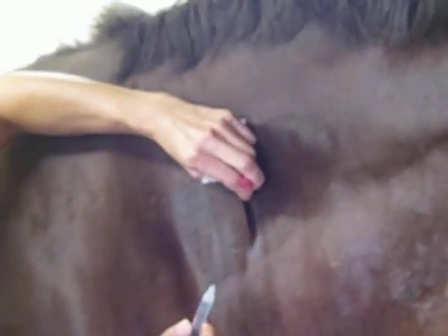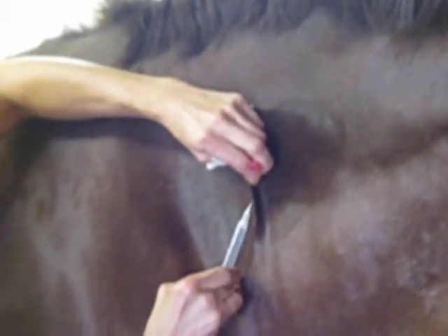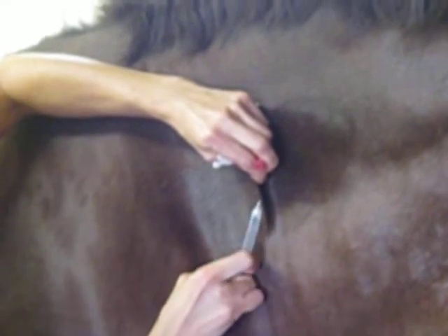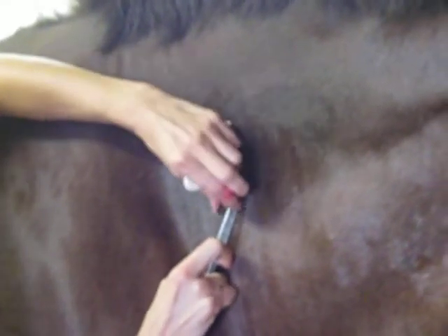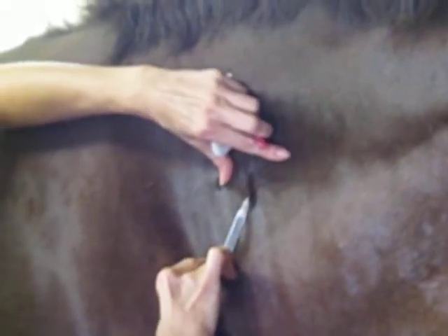I'm going to put the needle in under the skin. I'm going to aspirate back to make sure I'm not in any blood vessel. And I'm going to inject.